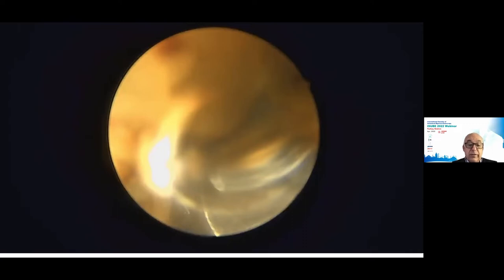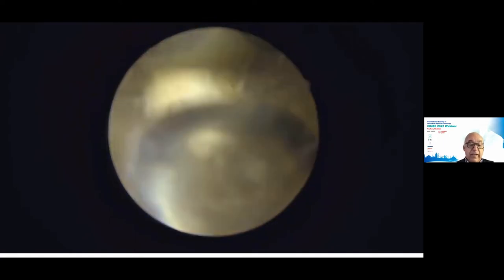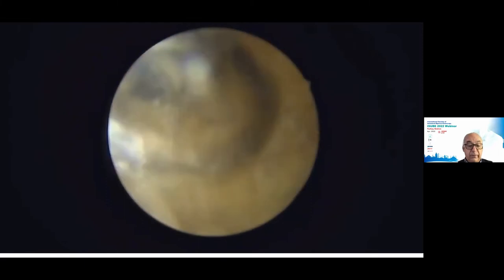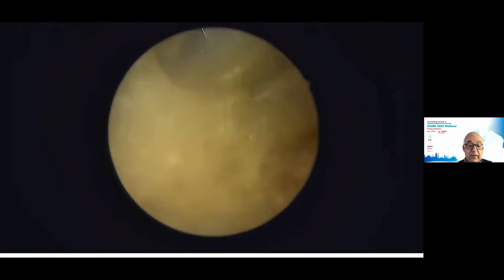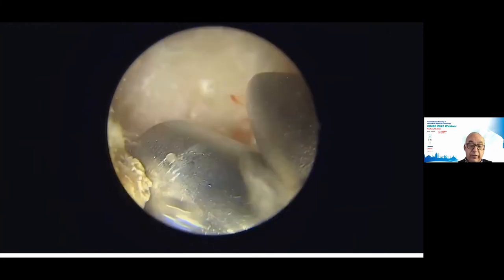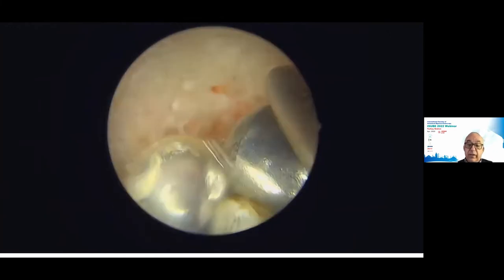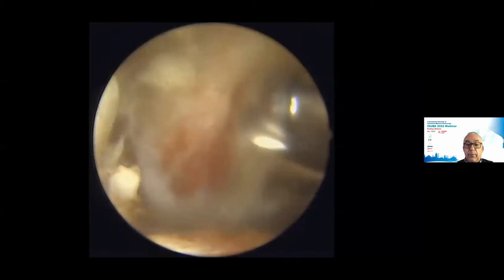Finally, you can start the canal decompression. As I mentioned, the main point is the junction of the lamina and the spinous process. With the radiofrequency device, at this point, we clean the fat and connective tissue medial to the multifidus muscle, exposing the lamina. This is done with radiofrequency ablation, as you see in the movie, and afterwards, with the Kerrison, we will take part of the lamina.